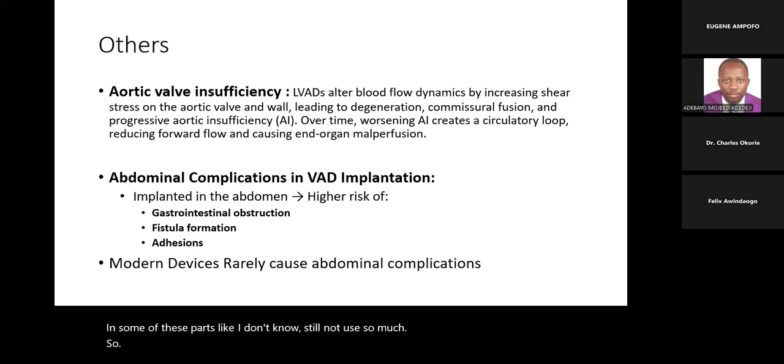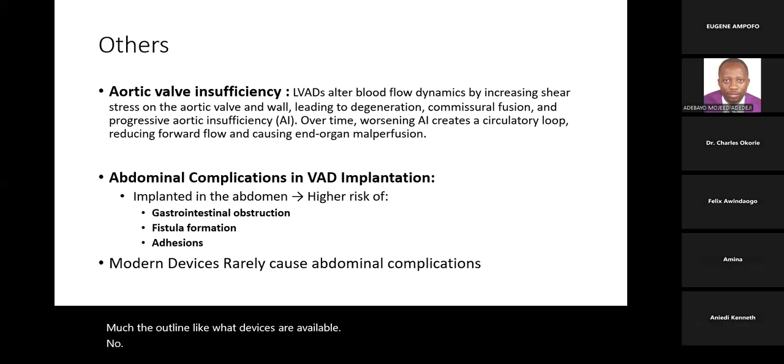But Charles, what's your comment on the RVAD? What devices are available, and how do they work? Are they the same principle or do they have different principles underpinning how they function?